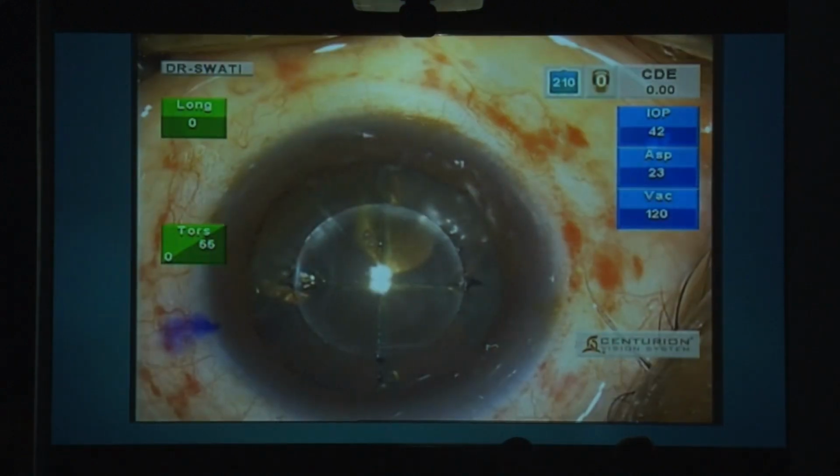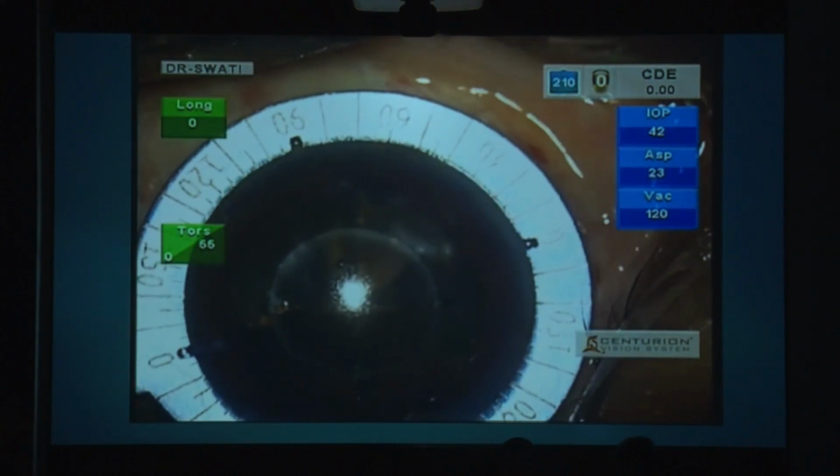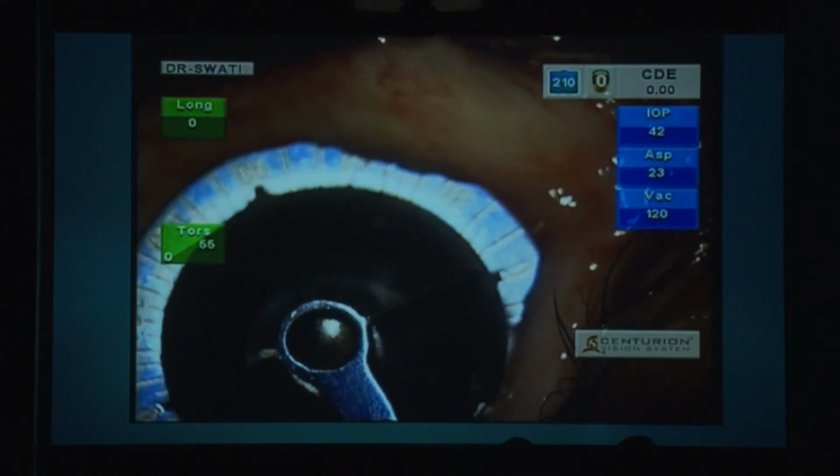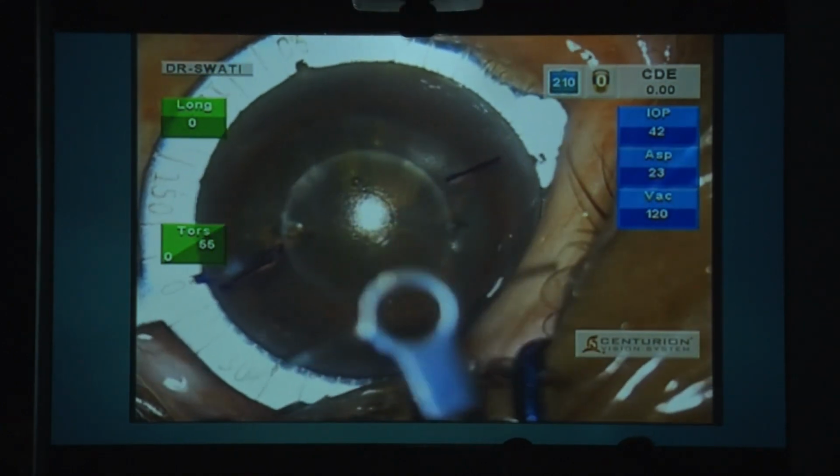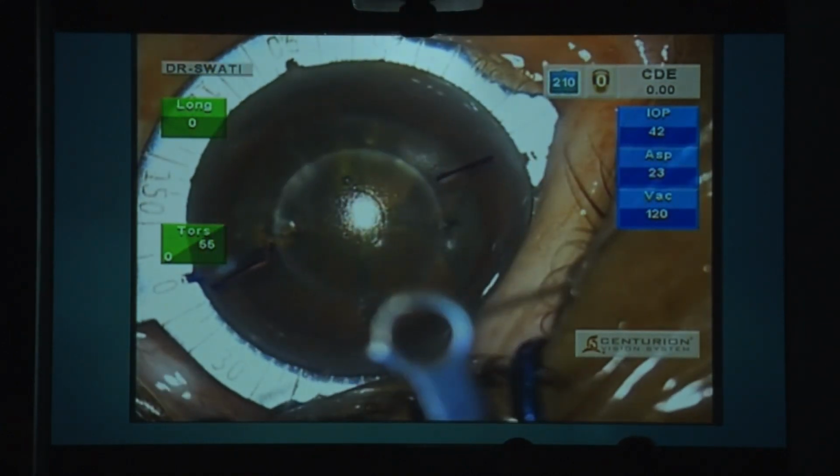So this was a patient. The phacofragmentation with the femto laser has been done and the femtorhexis has been done. So I'm also marking with the ink. After the Mendes ring has been applied, we can see that below the rings there is a faint axis mark which has been made intracorneally by the femto laser. So it is very accurate as far as my experience is concerned in all the femto toric cases I have done till date.